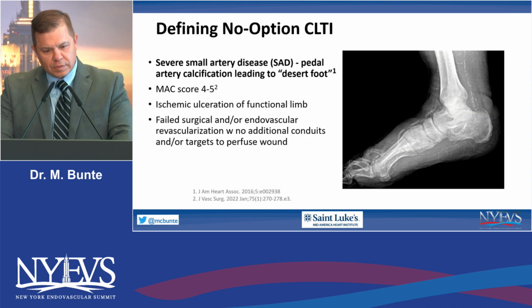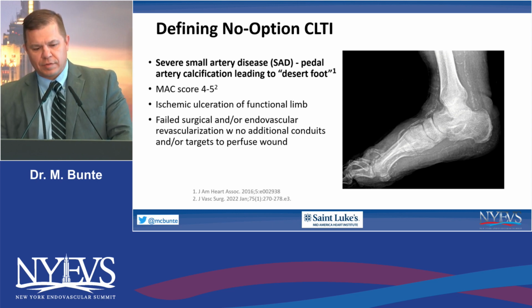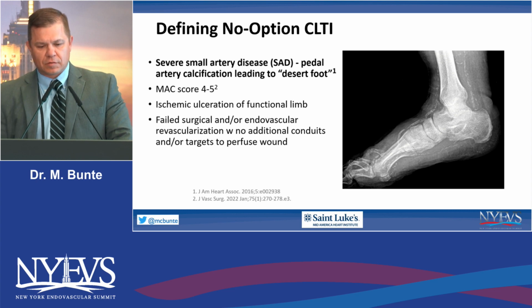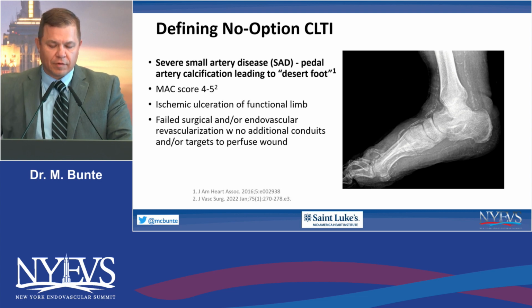So Dr. Chopra talked about what CLTI is and what our endpoints should be. And I think the goal of this procedure is making sure that we've exhausted all options, all conventional surgical and endovascular options. Many times these are patients with SAD, small artery disease, represented by the calcification seen as lateral foot projection. Ischemic ulceration of a functional limb.